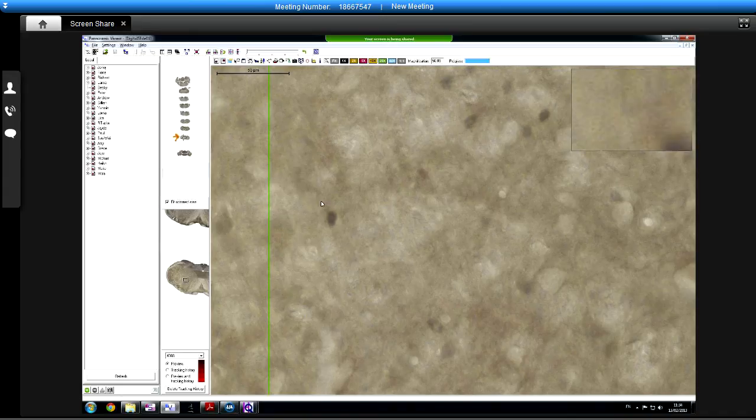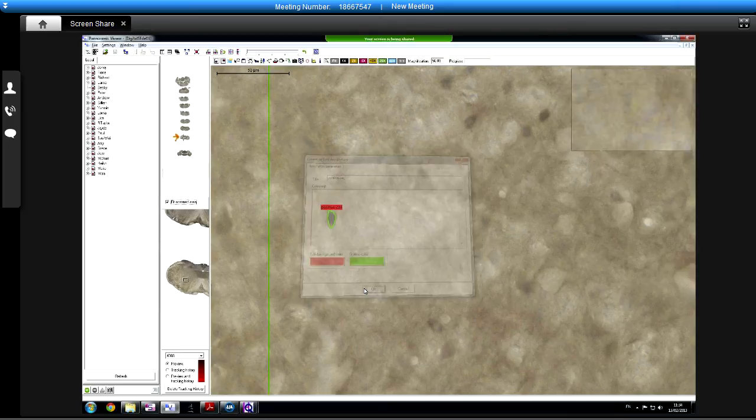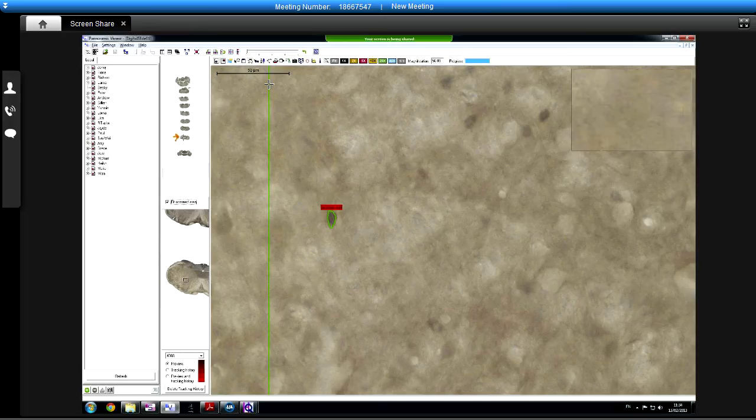No. Okay. So shall I just quickly mention these then, as to take a step back? So you know about opening slides, moving around the slides, I guess already. Yeah. What you see up here is my annotation tools. So the square one is the one I used earlier to mark the whole rectangle. Just click on it, drag it out into the appropriate area.